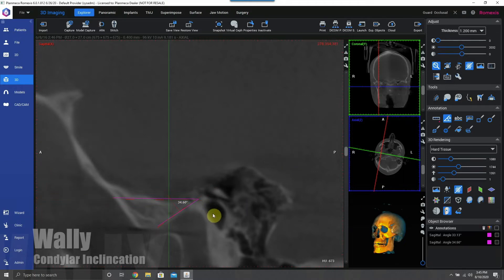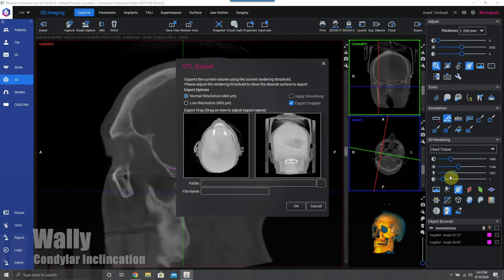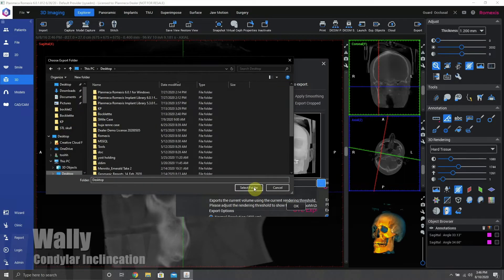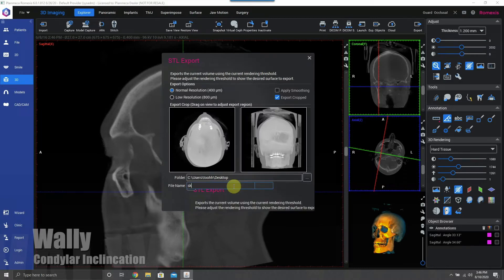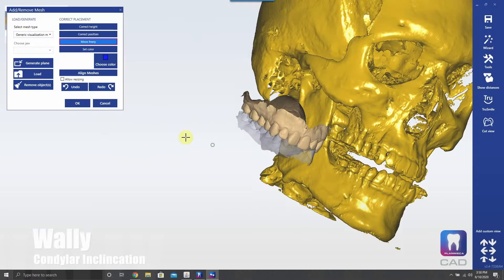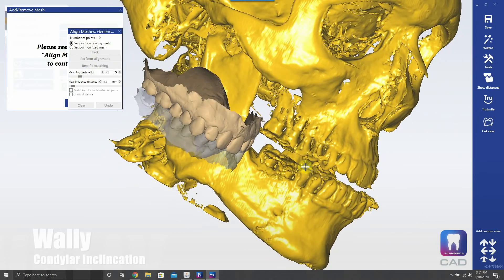Most people fall around the 35-degree mark, or between 30 and 38, but sometimes it's like 60 — it's just people's anatomy. Now I'm going to export this whole thing as an STL file, export the volume as STL, adjust the threshold, and bring it into PlanCAD Premium, which is ExoCAD.